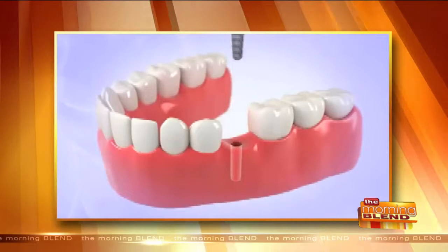So tell me exactly what a dental implant is, because I feel like a lot of people get confused when it comes to implants and the process and what they are. Sure. So basically a dental implant is a system where we're replacing a tooth with, in this case, for example, a titanium implant. Some people call it a screw. I don't like calling it a screw. It's basically a prosthesis that we put inside somebody's jaw. Sounds like you have a mechanic in your mouth.